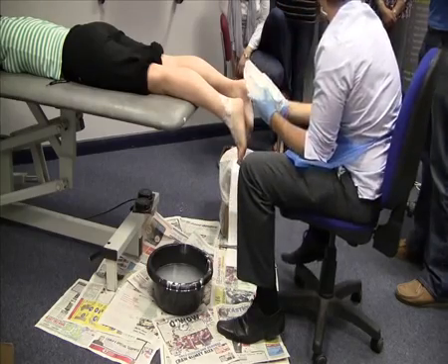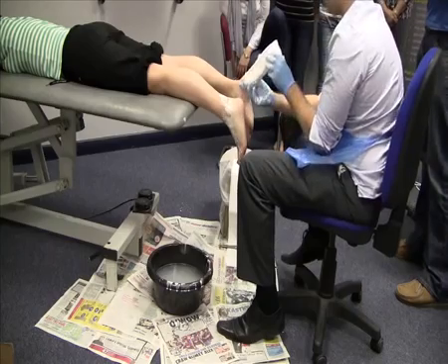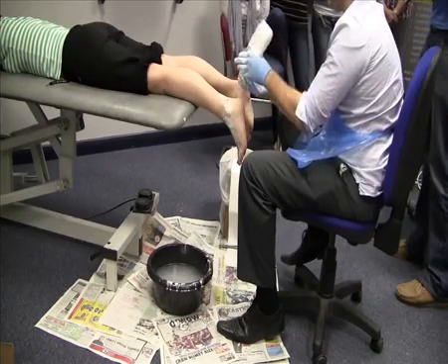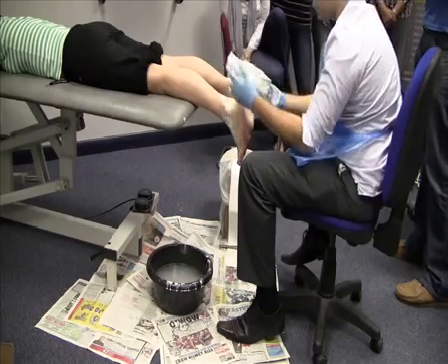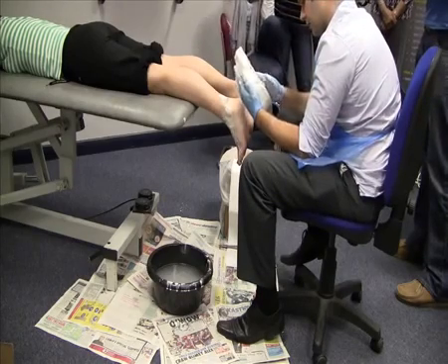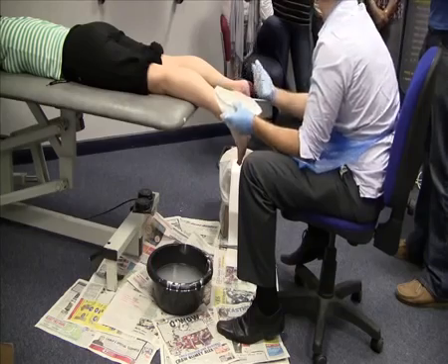If you've done this at the end of the day, leave it overnight to dry. If you send it in, it does take about 6 hours to dry properly. But what you want to capture is a little bit of the base of the malleoli, so you've got a slight bulge on the side. Nice even base layer. Have a look inside and see whether there's any lumps and bumps that shouldn't be there. If you like, you can push the thumbprint out. Doesn't matter too much, you can leave it. It's up to you.